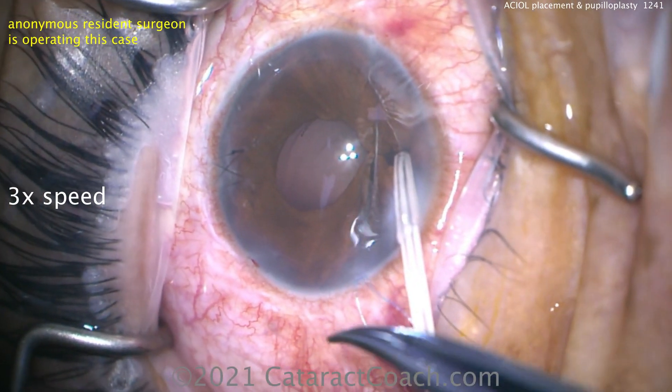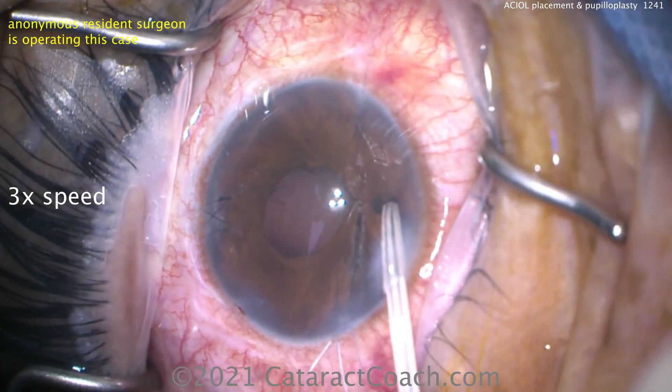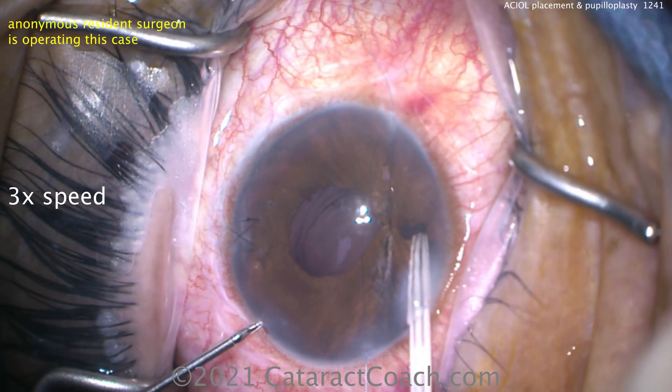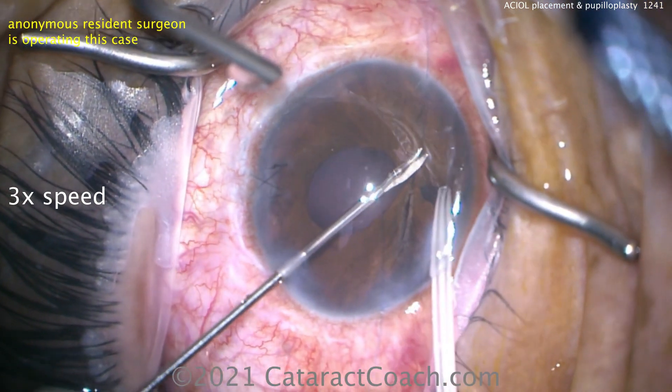Now for the lens option — what are your choices? You could do a Yamane, you can do a Gore-Tex suturing the lens to the sclera, or a lot of different things. In this case, however, what we're going to do is just place an AC lens.